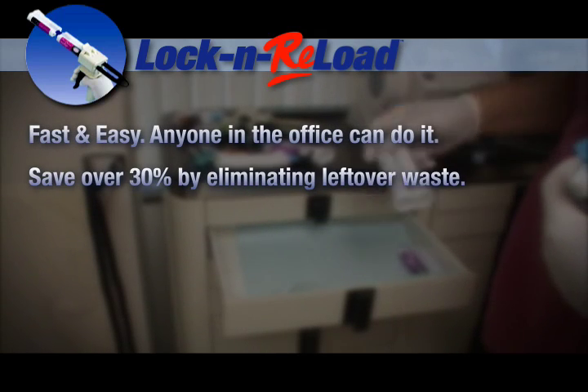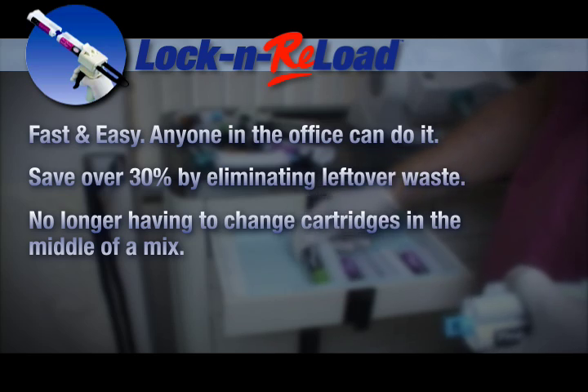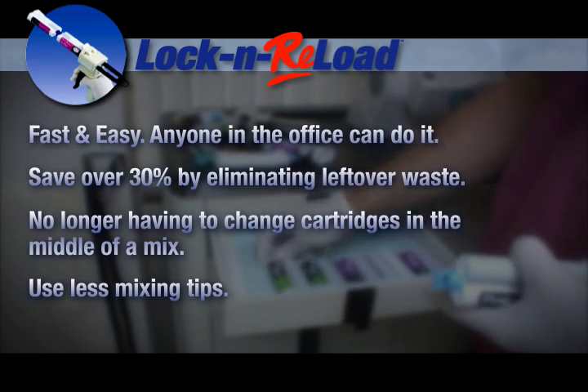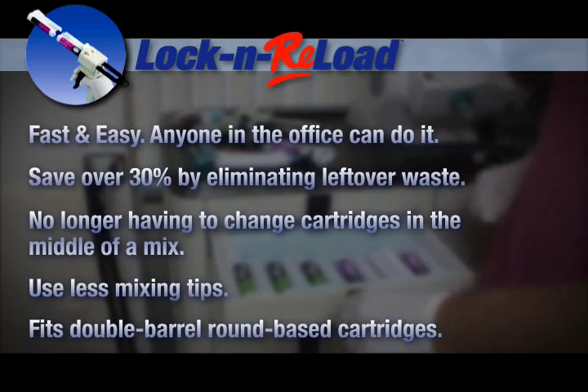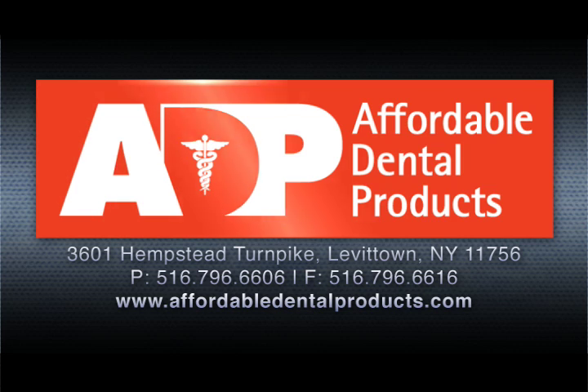Save over 30% by eliminating leftover waste, no longer having to change the cartridge in the middle of a mix, and using fewer mixing tips. Fits double barrel, round-based cartridges. Order your Lock and Reload Couplers today. Call 1-516-796-6606 or visit our website at www.affordabledentalproducts.com.